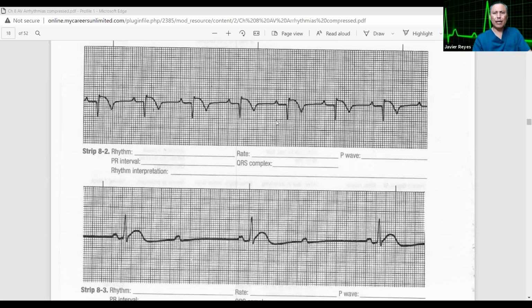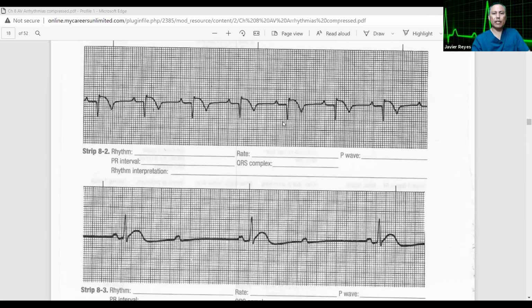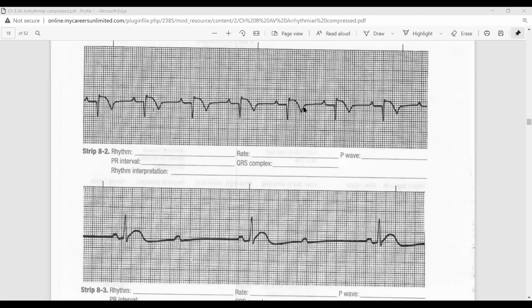So this is not a very easy example to look at. When you saw it, it's like, oh my God, what the heck is that? You thought this was the R wave, right? Inverted. This is what we call a deep Q wave, or a significant Q wave that is taller than your R wave over here. Your R wave is very visible. And then your ST segment has ST elevation with inversion.